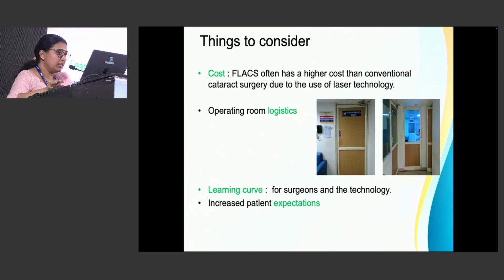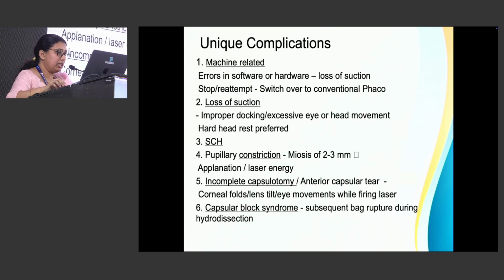So the things to consider are the cost, because the higher cost compared to conventional cataract surgery is due to the technology, and the operating room logistics, we need 2 operating rooms. The learning curve is a bit high for the surgeon, and there is an increased patient expectation.